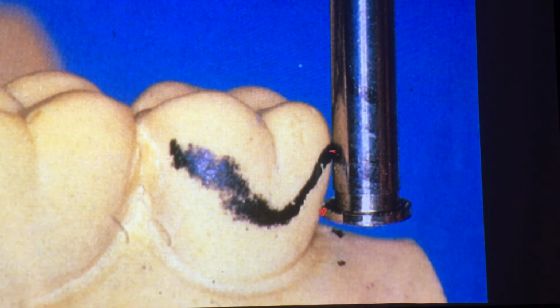This is touching the survey line or the height of contour, and the undercut gauge is 0.25 millimeters touching the tooth here. So this will be the terminal end of a clasp, let's say. So let's simulate this would be our most popular Acres clasp or E-clasp, that only the terminal third of a cast chromium cobalt wire will engage below the height of contour.